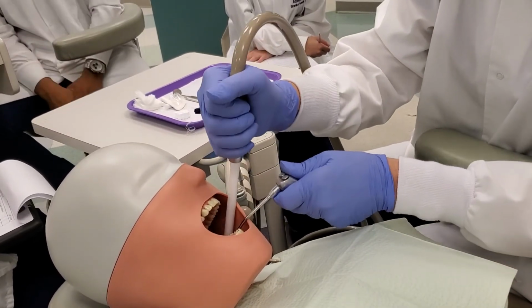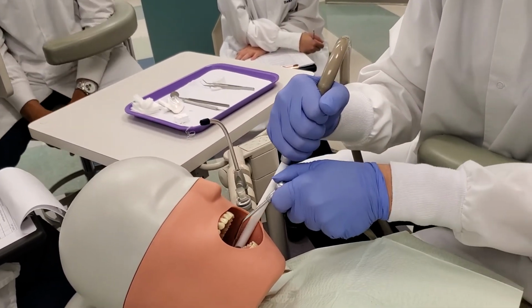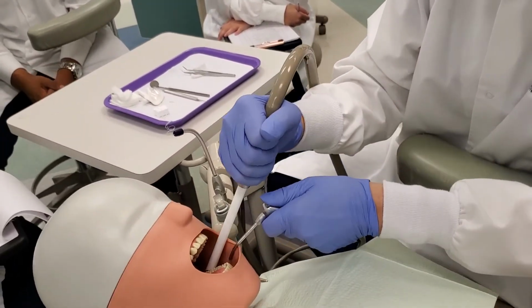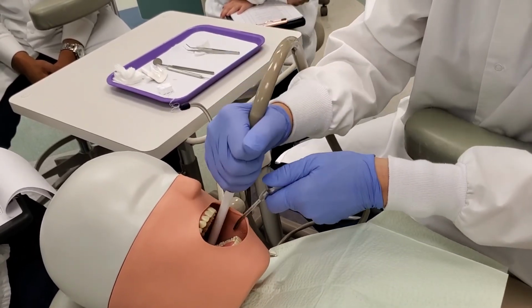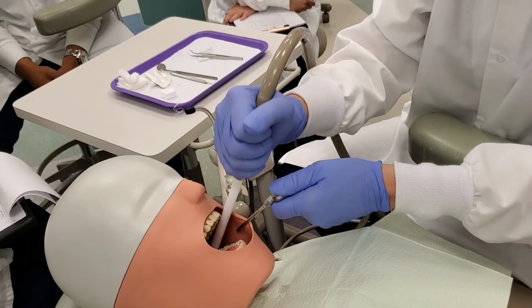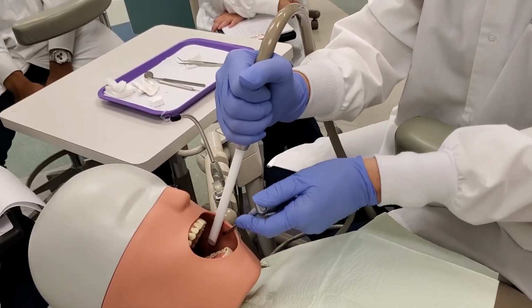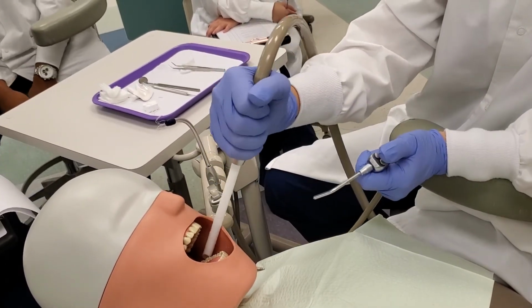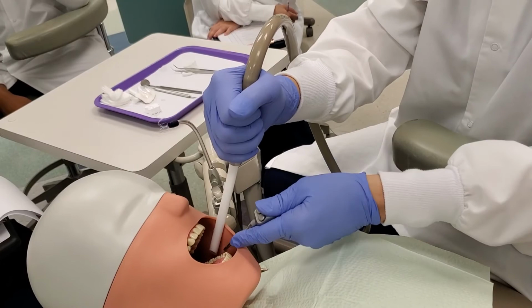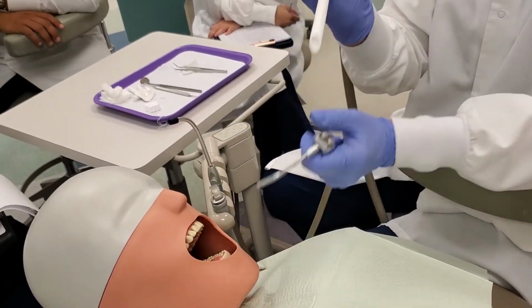Okay? If you're going to do a lower, same thing. Retract, place this where it needs to be going, and then come all the way up to the front, and then all the way back, getting the water in the back of the throat, coming up, coming back, getting the water in the back of the throat. And when I'm coming back in with the air water syringe, with the HVE tip, I'm retracting so I can get a better view, okay? Because if not, that's when you're going to be sucking tissue. Always use this to retract as much as you can if you are going to be moving this guy, okay?